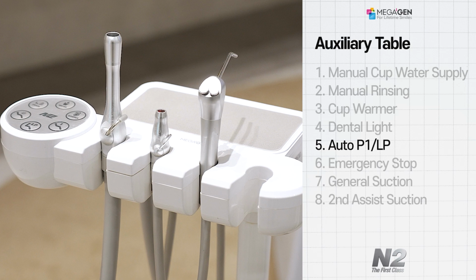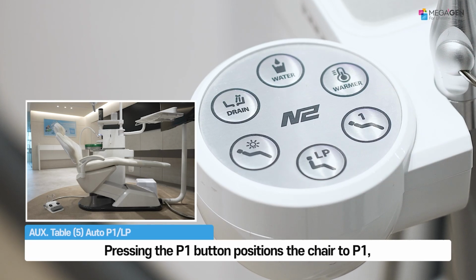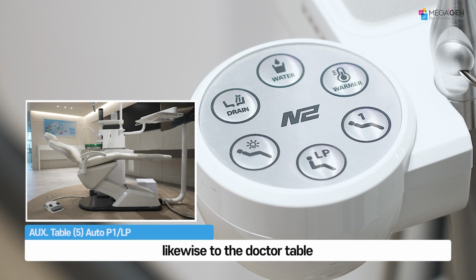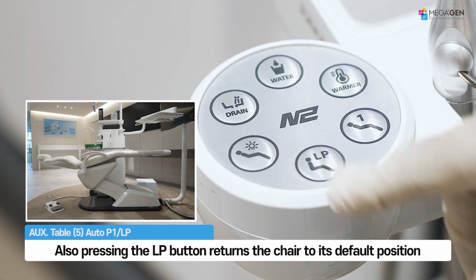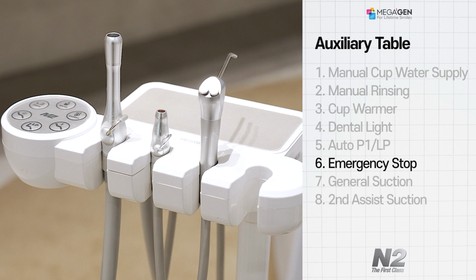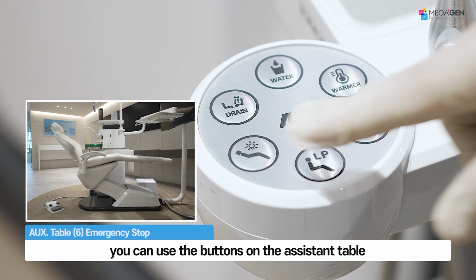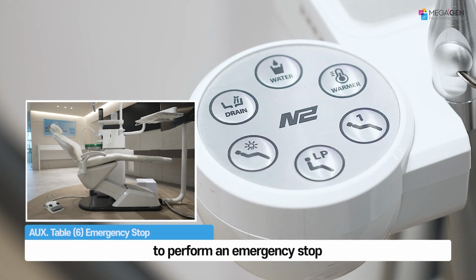Automatic position, P1 LP function. Pressing the P1 button positions the chair to P1. Likewise to the doctor table. Also pressing the LP button returns the chair to its default position. Emergency stop function. In case of an emergency during chair operation, you can use the buttons on the assistant table to perform an emergency stop.